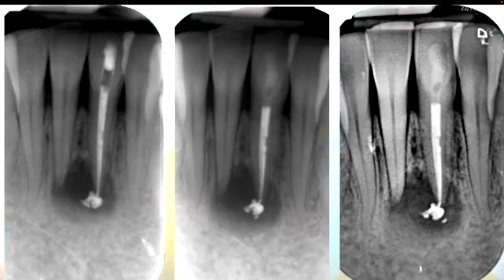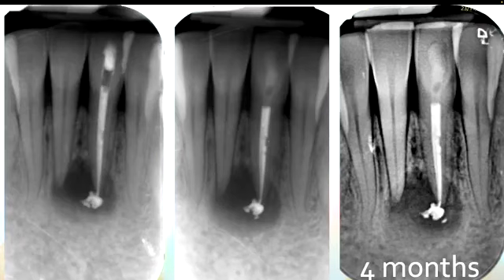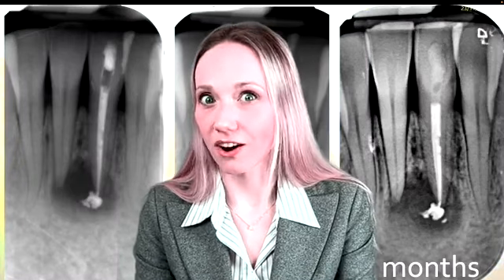And as you can see, 4 months later, the lesion is healing and the other tooth started responding again to the vitality test. So never trust the vitality test too much, and if possible try to delay the endodontic treatment of the nearby teeth in these cases, because when there is one that is with no doubt responsible for a lesion, maybe also the others can be involved, but start treating that one. Give a chance to the other teeth. In this case, things are going well, and I'll keep you updated on what will be next in the next month.